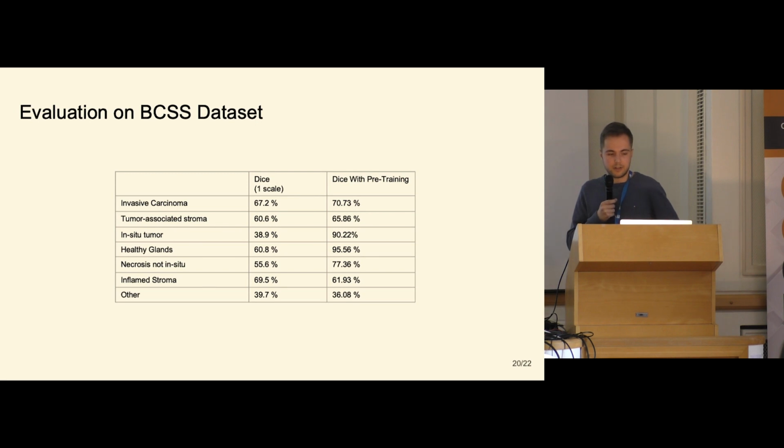And after fine-tuning, we discovered that it significantly improved within in situ tumor, healthy glands, and also within our other classes, mostly within classes that are visually different from each other.